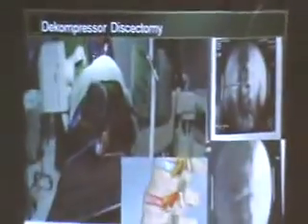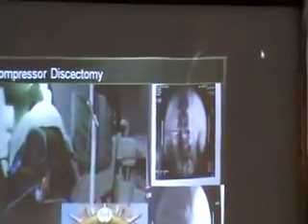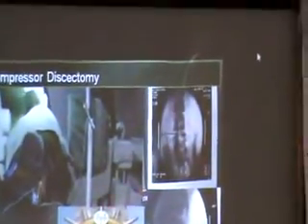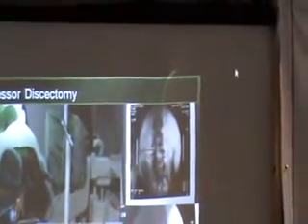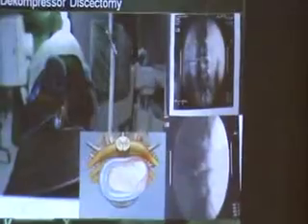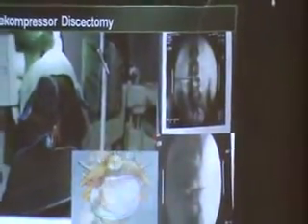Simple 30-minute procedure. Put a cannula into this L4-5 disc actually, and through that a small drill sucks out part of the disc. Just takes 2-3 minutes. You keep the drill 3 minutes, and the pressure inside the disc will go down. So the bulging will be reversed. So this is what I am doing there. So it took 30 minutes.